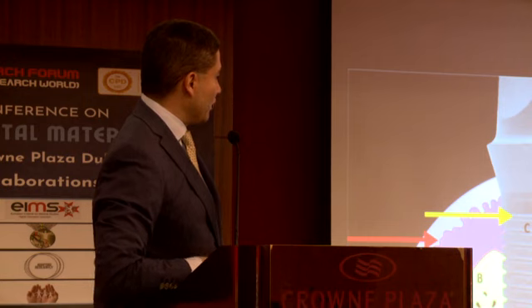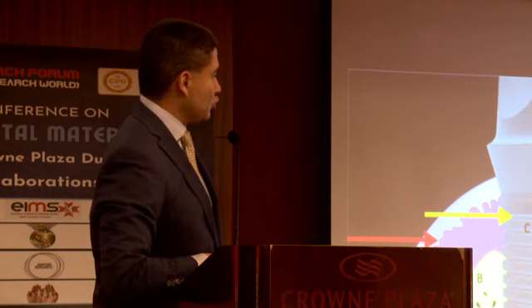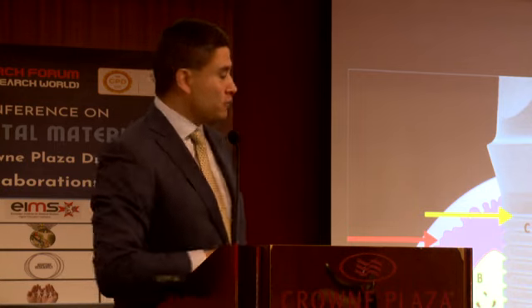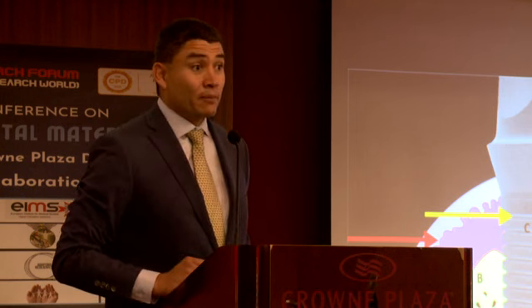How much are we going to be able to predict the platform shifting for the bone loss remodeling? Well, it's very simple. If we know that from here to here we lose 1.5 millimeters, and this platform shifts from here to here 1 millimeter, how much bone loss are we going to have from here down to here? 0.5, right?